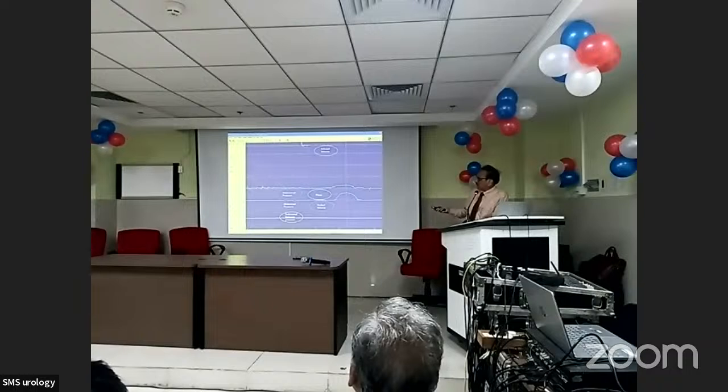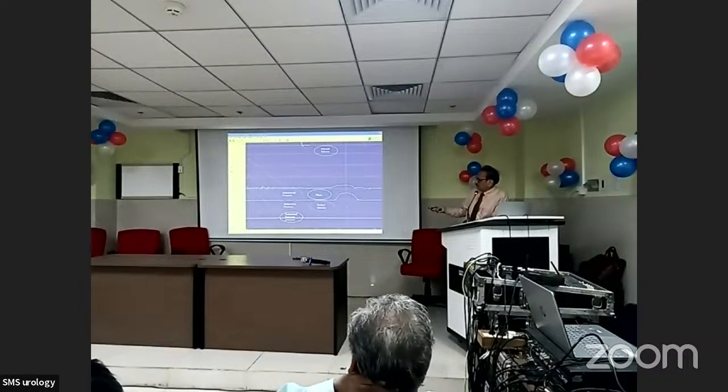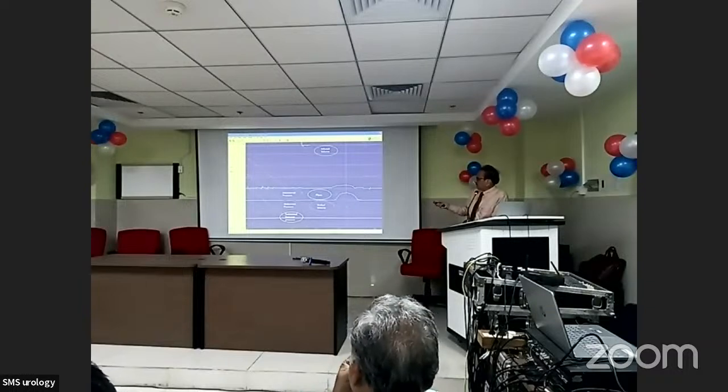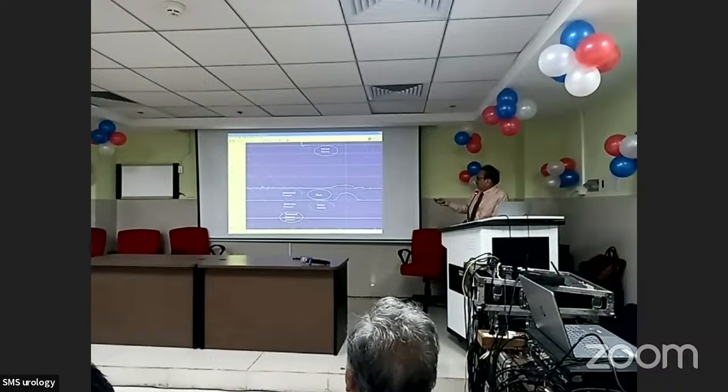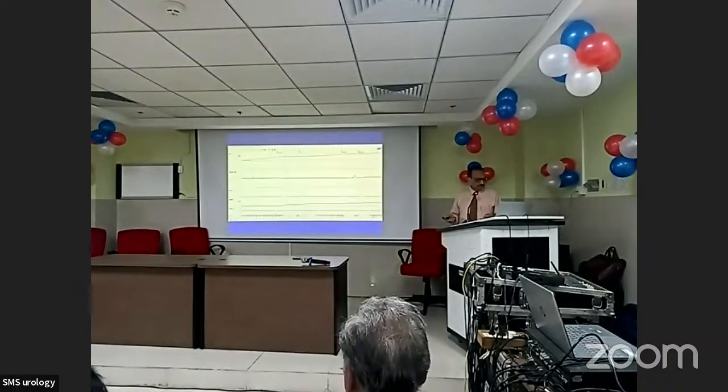There is a rise in the intravesical pressure, an equal rise in rectal pressure, and practically no rise in detrusor pressure. Before voiding, you check that pressures are right, and after voiding, also check that pressures are right. So you need to have quality in this.